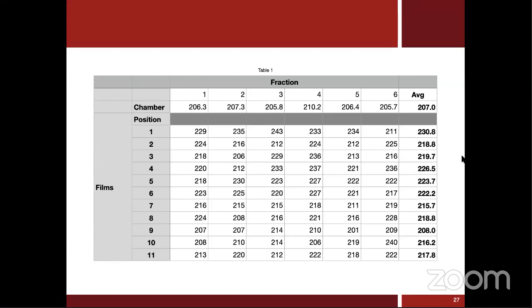Uncertainty, well, I really cannot tell. I will just take an average of these data. And in TBI, we usually want to deliver the dose to within plus or minus 10%. So for example, everything here is fine. This is just at the edge of 10%, these three readings, but these are at the armpits where the dose is actually a bit higher. These here are around the neck, okay, and they look fine.